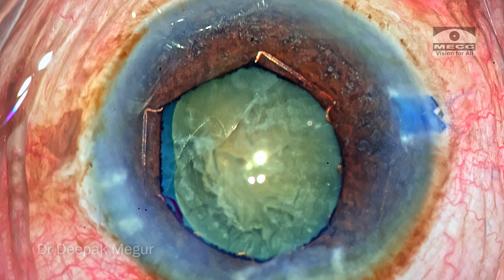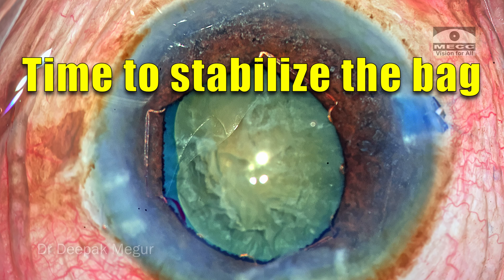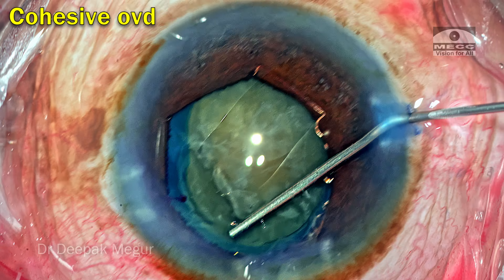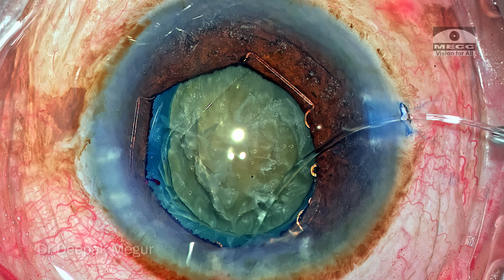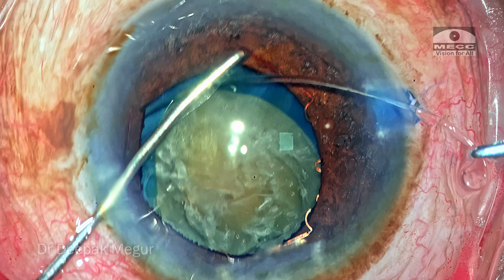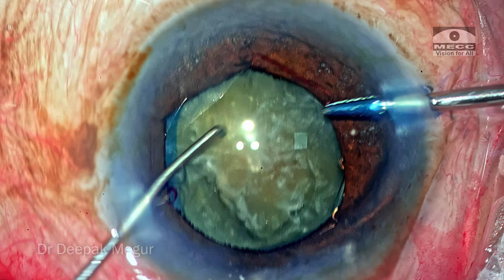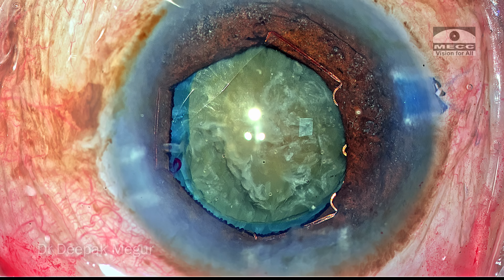The corticocapsular adhesions are now broken and the bag is free from its attachments. In such situations, my preference is always to go ahead and stabilize the bag with the CTR at the earliest. I am creating space under the anterior capsule using cohesive OVD, and a standard 11–13 mm CTR is being threaded into the bag. The terminal edge of the CTR is held with micro forceps and gently guided under the rhexis margin, giving 360 degrees of equatorial support to the capsular bag.